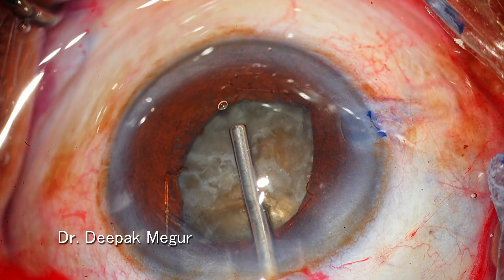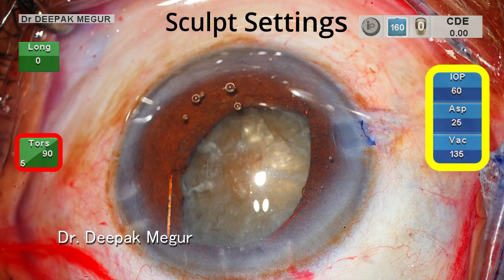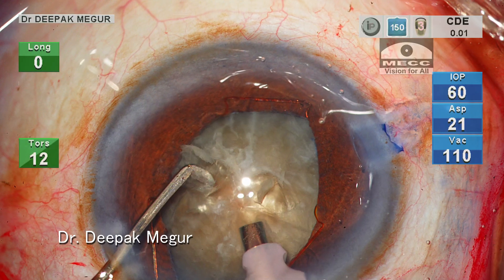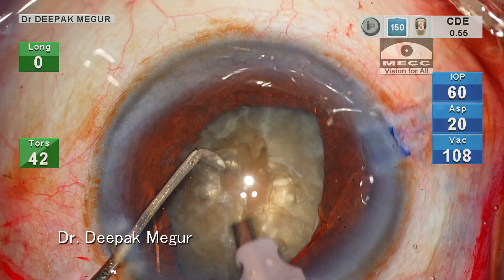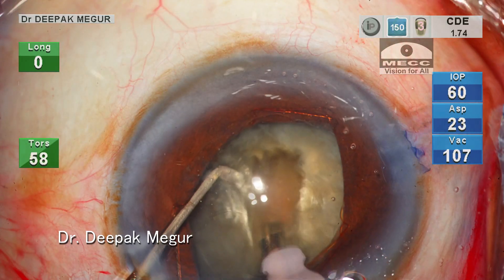Now moving on to nucleus management. My typical strategy in such eyes with dense nuclear cataract is to first create a central deep trench before proceeding to chop. I have created a trench of about 70 percent depth.